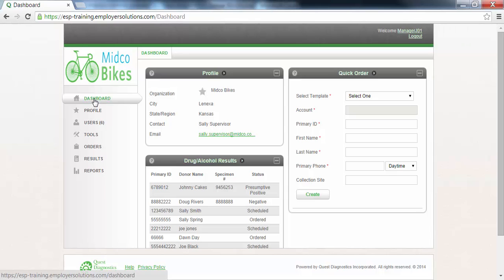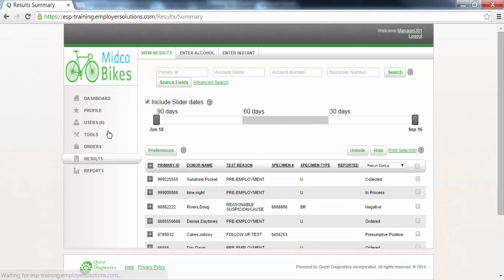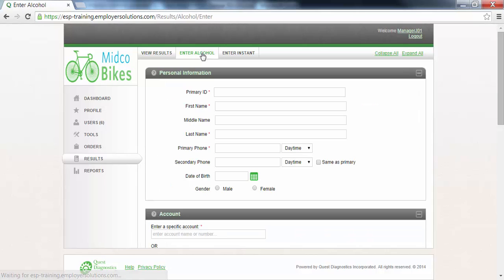To enter a breath alcohol result click on the results menu in the list of menu options available at the left. If your user account has permissions enabled you will see a number of tabs at the top of the page. Click the enter alcohol tab to begin the process of entering a breath alcohol result.